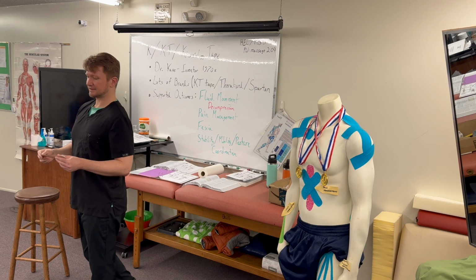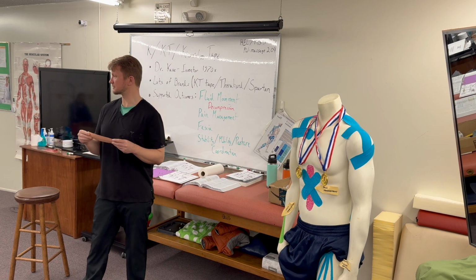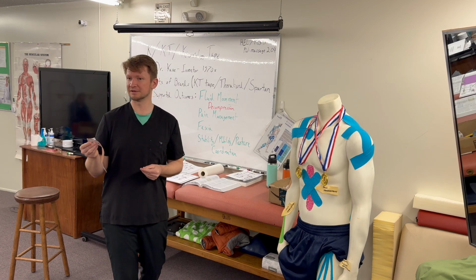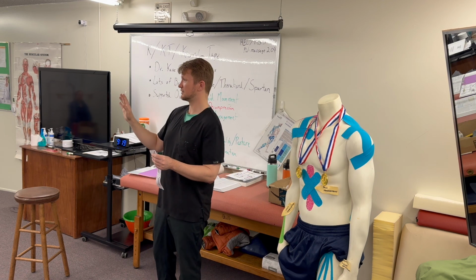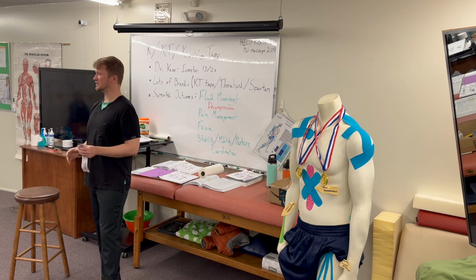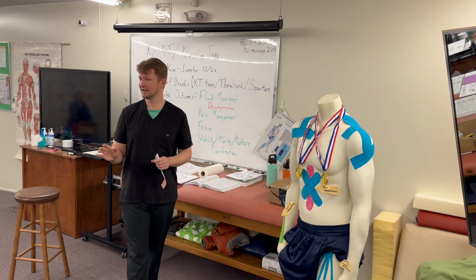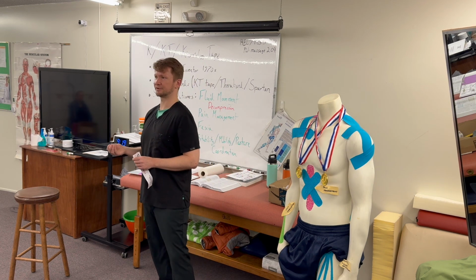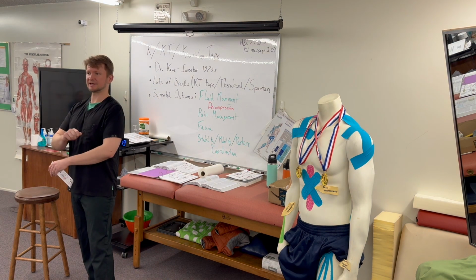The factor with that, and we're going to start with just elements of things to be careful about, with stuff to be cautious about. It's the adhesive. How sensitive are people's skin related to this adhesive? So if anybody here has sensitive skin to the point where they've responded negatively to tapes and stuff like that, we can modulate how much you're getting it put on you, all that kind of stuff. That's just the concern you have to voice to people when you're putting this on them for the first time. That in the event that their skin becomes irritated, red, itchy, it's time to remove it.